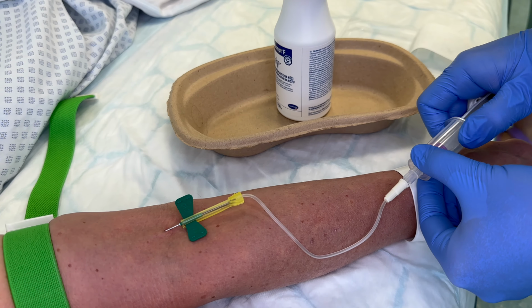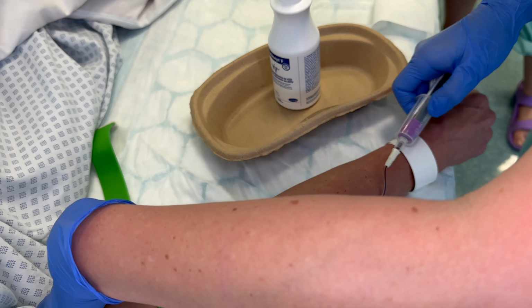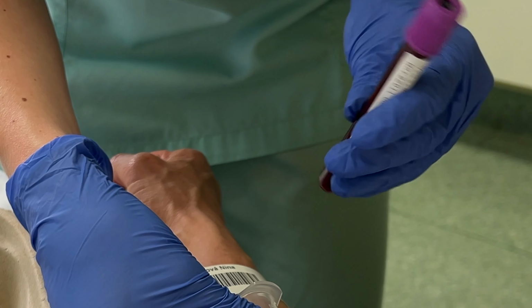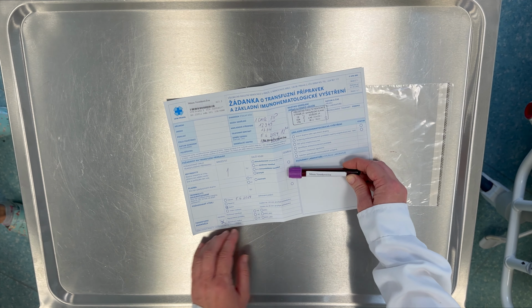Misidentifying the patient during blood collection can lead to fatal consequences such as acute or delayed hemolytic reactions. Therefore, it is essential to verify the patient's identity by matching the ID on the tube label and the request form. The healthcare worker is responsible for the correct collection, labeling, and identification.